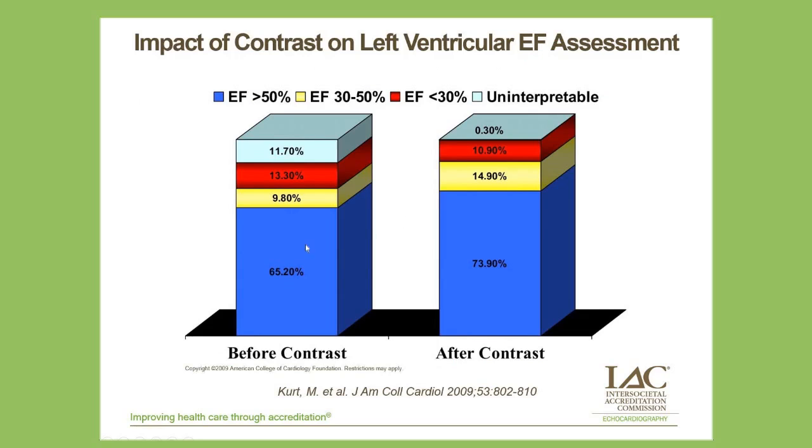This kind of outlines those clinical situations where it may be beneficial. This was a study done by Dr. Kurt at Baylor University in conjunction with Dr. Zogby, which looked at the potential for a contrast-enhanced echo to improve the ability to assess ejection fraction and make a non-diagnostic study diagnostic. And you can see that the ejection fraction, which is a critical factor in regional wall motion in these patients, was not even able to be detected on the unenhanced echo in 12% of cases. That improved to 0.3% that were uninterpretable after using low mechanical index contrast-enhanced imaging.